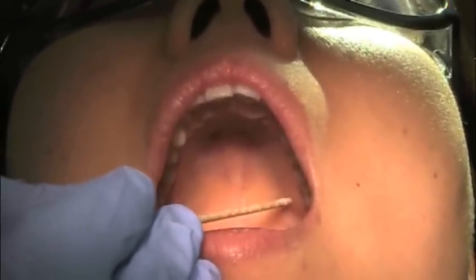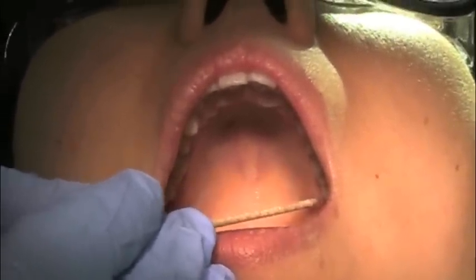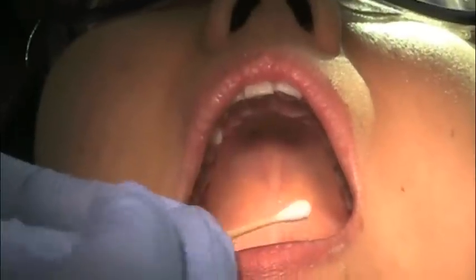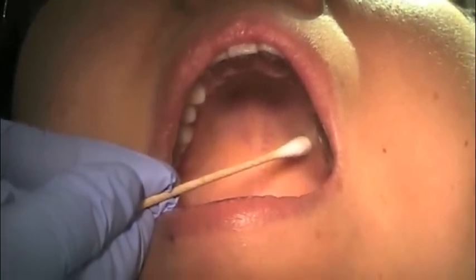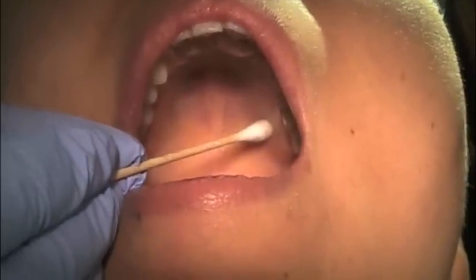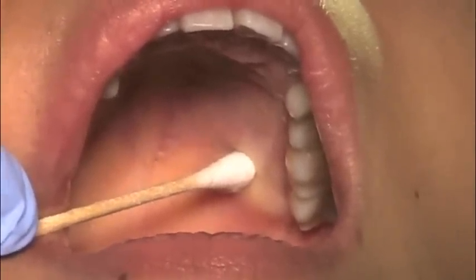Identify the junction of the hard and soft palate. Find the soft, depressible area on the hard palate where the greater palatine foramen is located. Pressure anesthesia is applied until the tissue blanches.